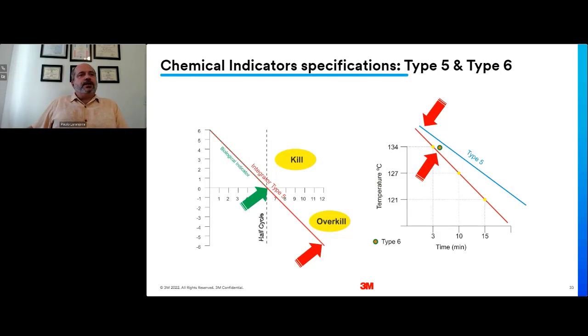As you know, biologic indicators have the capability to monitor 6 log reductions, plus non-condensable gases and superheated steam. So biologic indicators are the guy, right? They are really the indicators that we have today. But we also have chemical indicators that are good to place on our load because they can be looked at after sterilization, after sending the package to the surgical suite. To mimic the performance of a biologic indicator, we have type 5 chemical indicators that are integrators, and they are capable of integrating a reduction of 11 to 12 logs in the sterilization cycle. So we use BI for the steam quality, and we use the type 5 for the 12 log evidence in the sterilization.